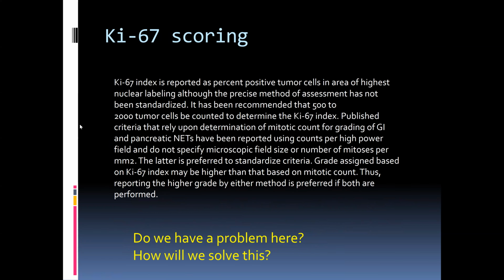Okay, so Ki-67 scoring. So you count the number of Ki-67 positive cells and divide by the number of cells that you've counted. As Beth and Michael know, we have validated or demonstrated that eyeballing your Ki-67 scoring is not as reliable and as reproducible as the manual counting, or preferably the automated counts using one of our automated slide scanners or a quantitative algorithm.